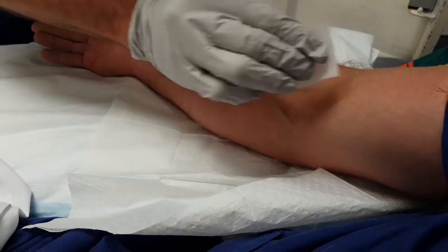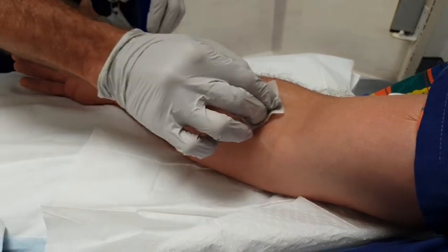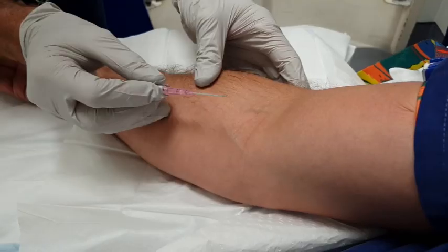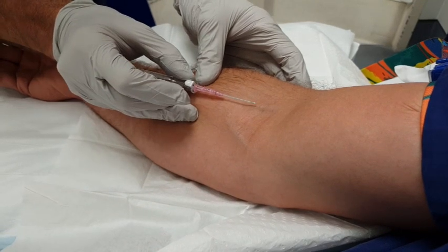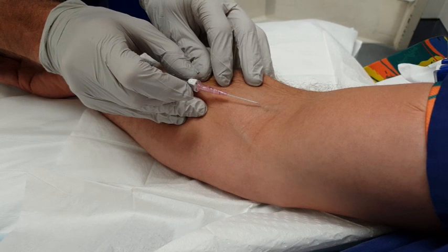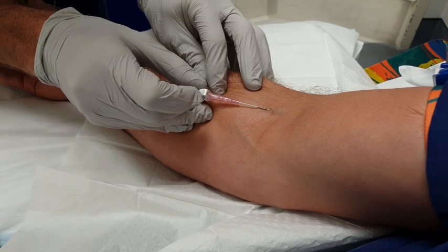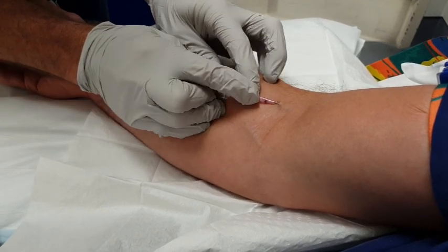I'm going to give Pat's arm a wipe and just let that dry. I can put a little bit of pressure here, and you can see the cannula is going to go in just here. I'll tell Pat when I'm going to do it so he's expecting it. You'll feel a little sting, Pat. A little sting — a little advancement — slide that on and up.